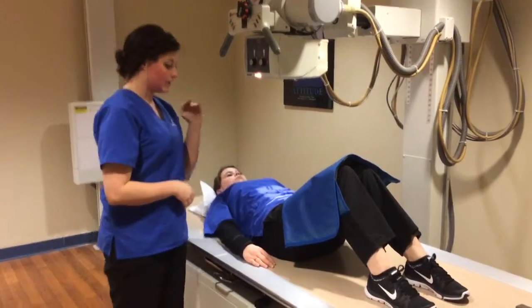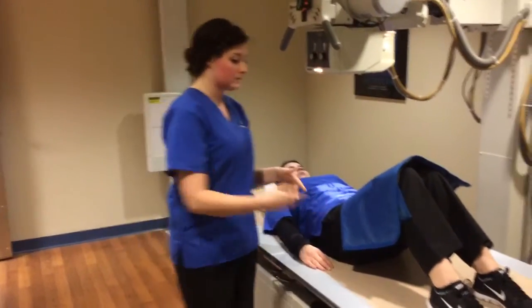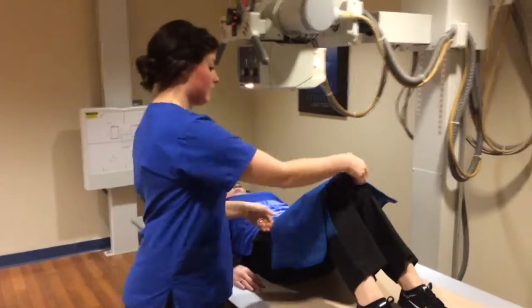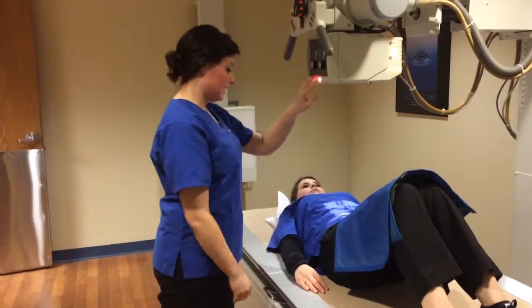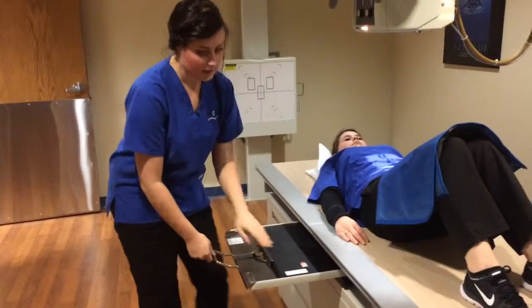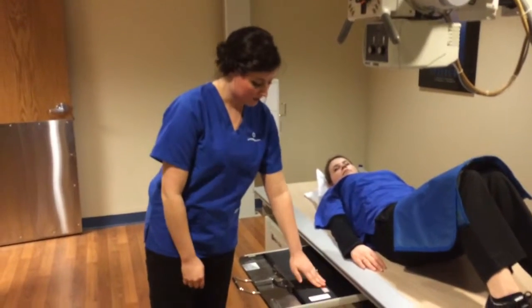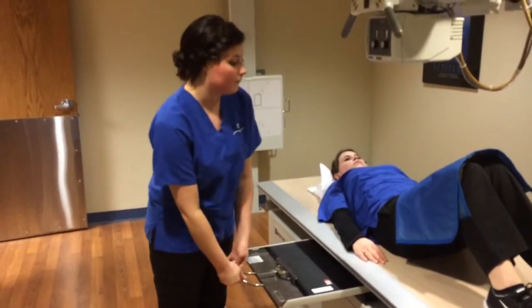Alright, to get started, I'm going to have the patient lay down flat, supine on the table, have their knees bent, which will just flatten out the curvature of the spine so that it's parallel to the IR. And then I'm going to have a lap shield placed just to cover the gonads from any radiation. And put a 14 by 17 lengthwise cassette into the Bucky tray, and I will have a right marker on the right side, which I put in 3 inches approximately from the edge of the image receptor for collimating purposes.